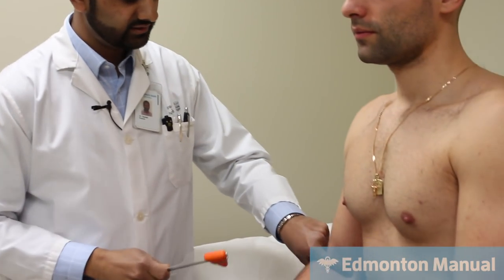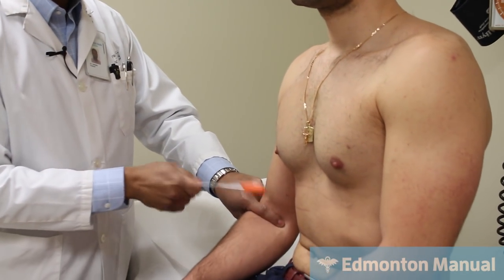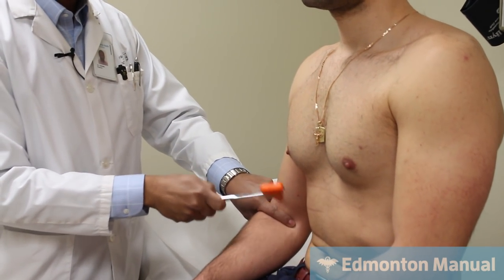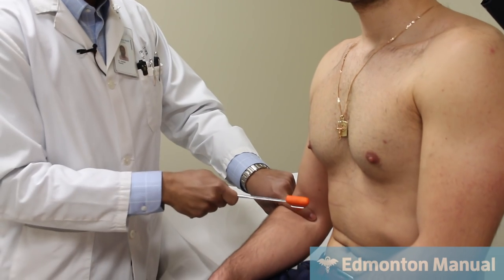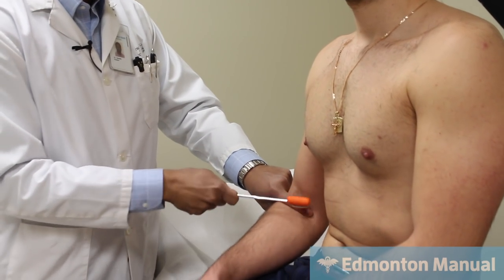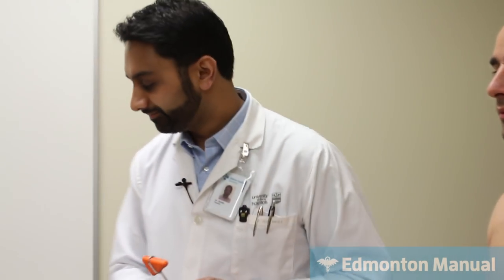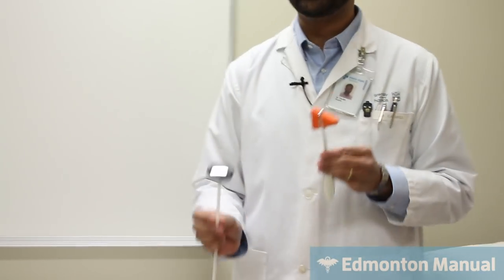If we do that, again, putting a finger on the tendon, this was holding it like a hammer the wrong way, you really don't get much. Whereas if you hold it properly, as you can see there, I'm getting a nice reflex. So you really do need to practice that though. And obviously be careful, don't let go. It can go flying across the room, but you do need to let it really swing. So that's the tomahawk. Now, the correct answer with almost everything in medicine is get used to something and use it all the time.